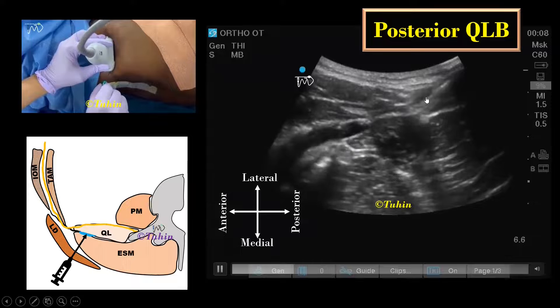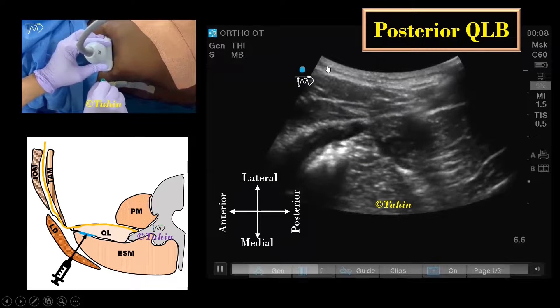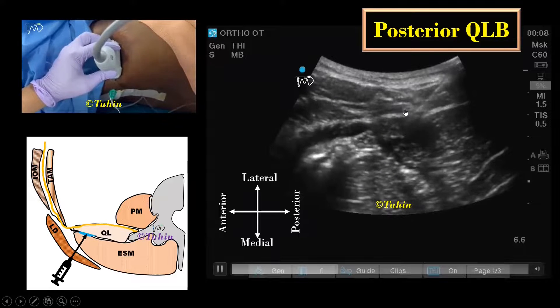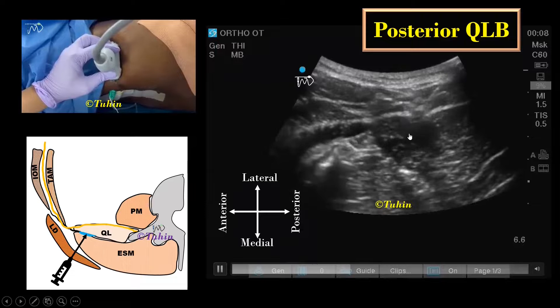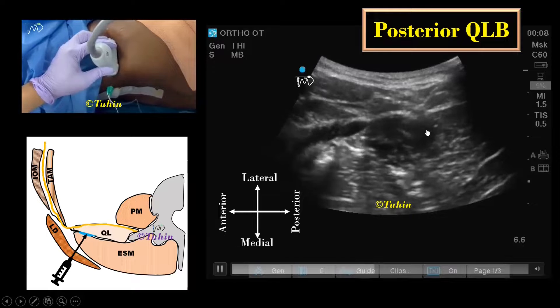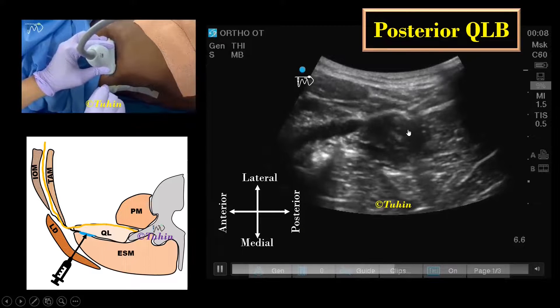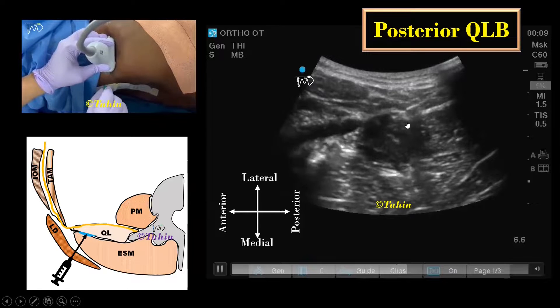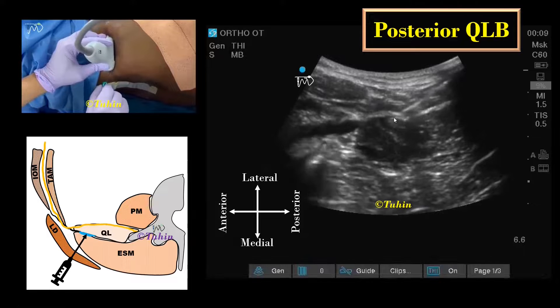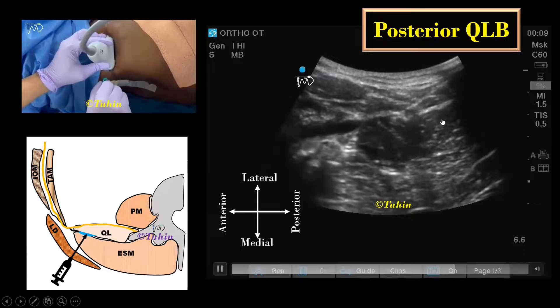The needle was inserted from posteromedial to anterolateral direction. You can also insert the needle from anterolateral to posteromedial direction. The optimal point of injection was determined by hydrodissection with 5 cc of 0.9% saline to produce a hypoechoic or anechoic image. After confirmation of needle tip position, local anesthetic was injected in 3–5 ml aliquots following negative aspiration for blood.